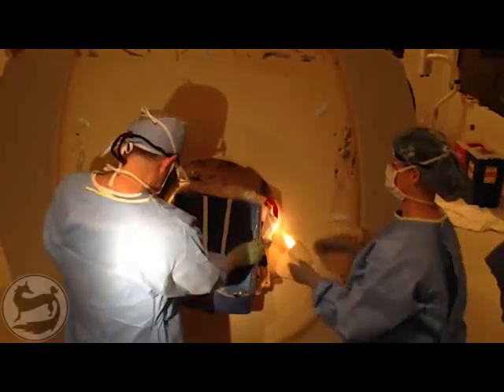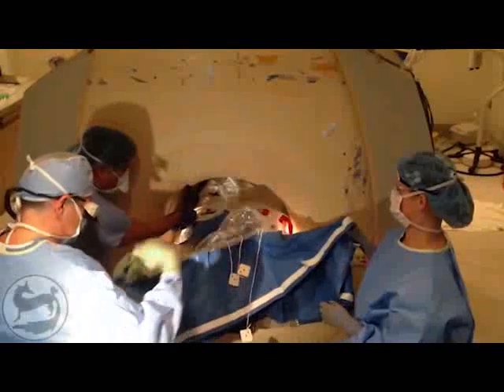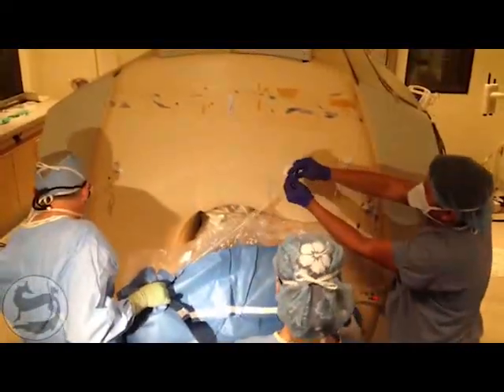A drape allowing for free movement of the patient from the surgical position to isocenter is placed. A set of elastic bands is passed to the far end of the bore, followed by a set attached at the surgical end.